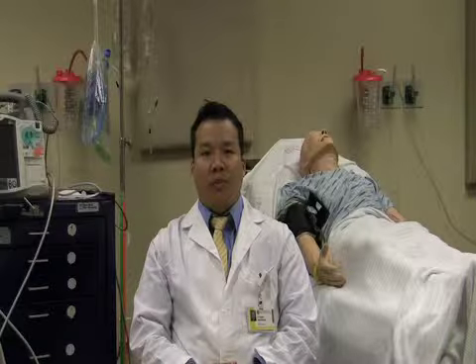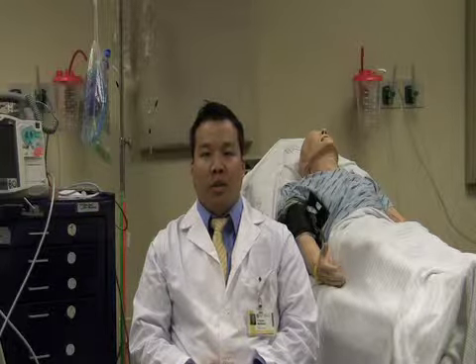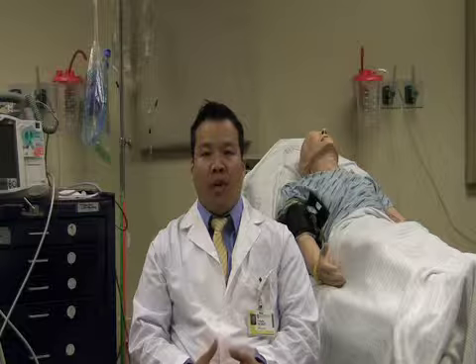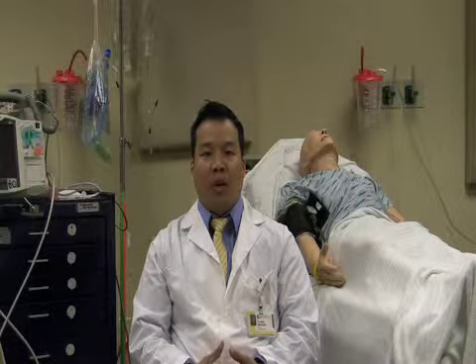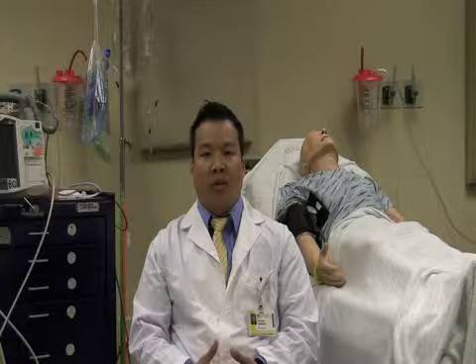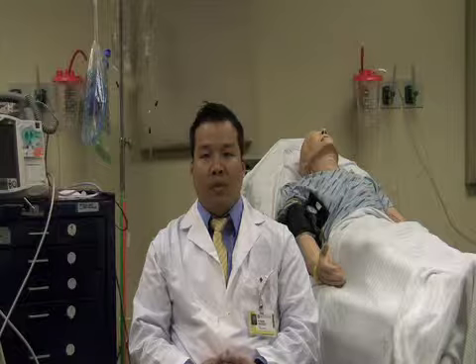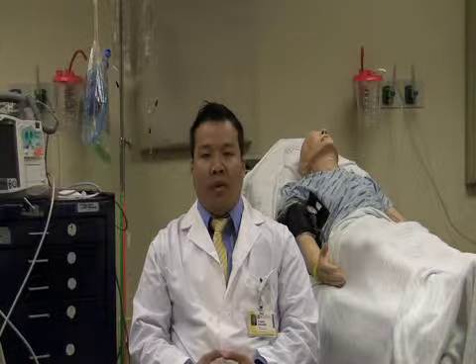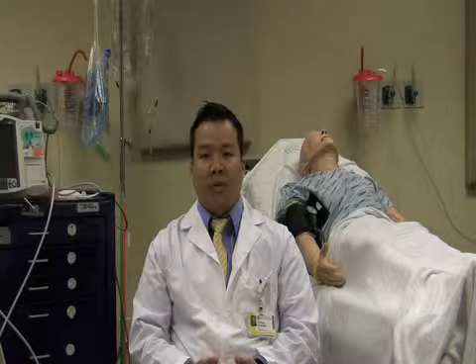Patients with pacemakers may present with a complaint of pacemaker malfunction. If these patients report that the pacemaker is firing inappropriately, this may be due to either a failure of sensing or pacemaker-induced tachycardia. These patients should be placed on a monitor, and by analyzing the strip, it can be noted whether or not the pacemaker is properly firing.